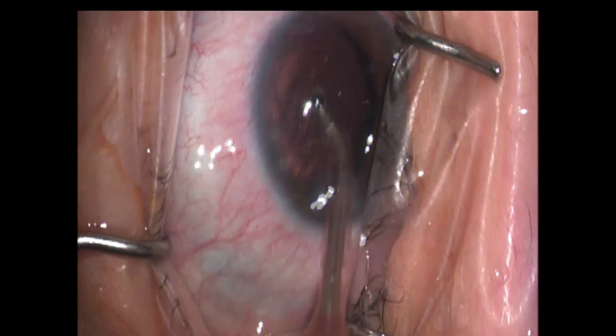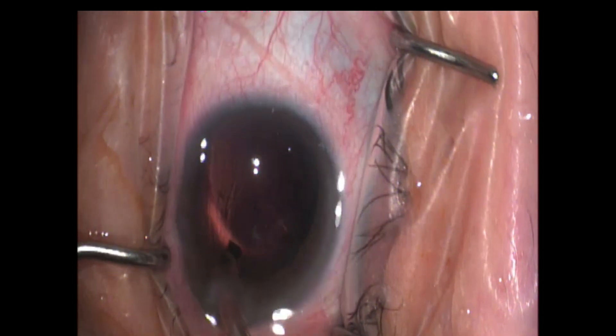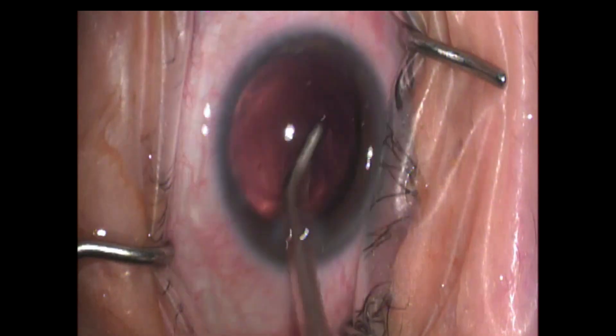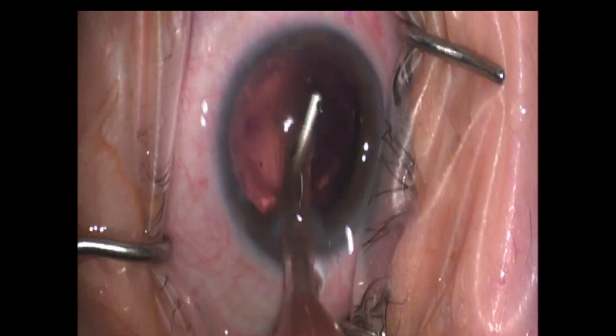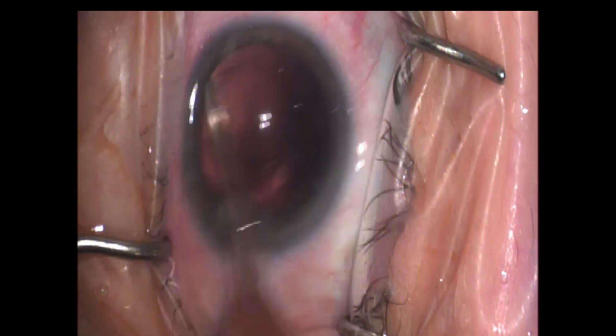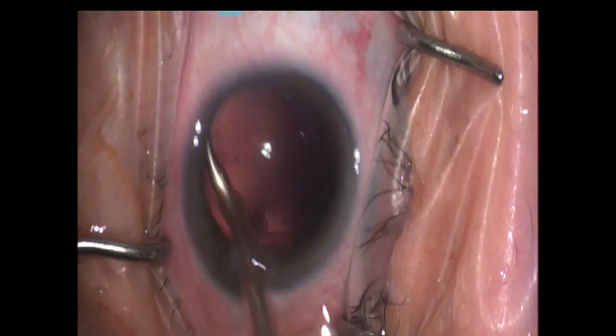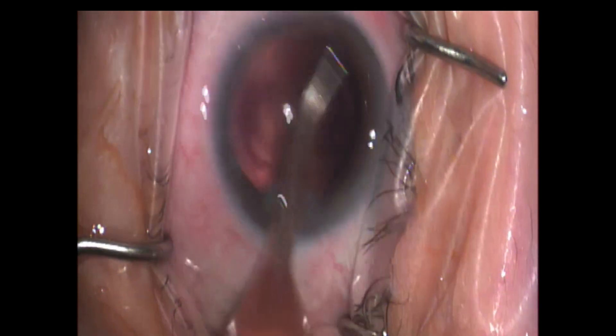That capsule is almost completely free here. This is where it pays dividends in the beginning to completely hydrodissect and see a free rotation of the actual cataract itself — that helps break up part of that capsular tension or grab. Here I'm doing a quick anterior edge polish and I keep that on my capsule settings.